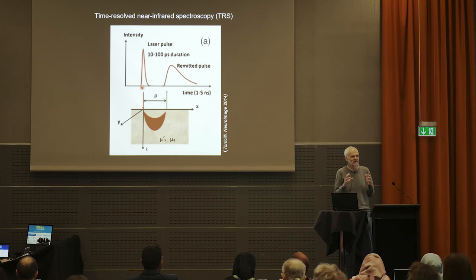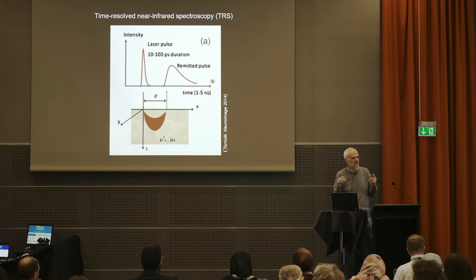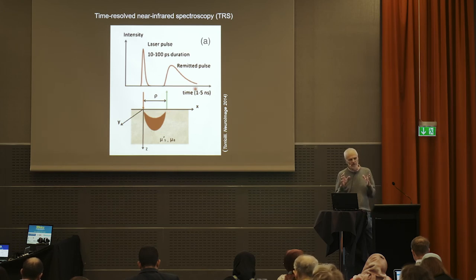It's somehow incredible. This is the same thing, a short pulse of light, and then the light comes back not at one instant, but in a spread out pattern. That's because the light which you have injected into the tissue is traveling around, and some goes directly back, and other photons have gone further astray and take longer time to get back. That allows you to look at those who come back late, because they have been far away, which means they've been deep into tissue. So that gives you simply a different way, and that is again the reason why you're able to detect at a distance. And that gives you, for physical reasons, a much better assessment of the absorption coefficient, and thereby a better definition of the hemoglobin spectrum, and therefore better saturation measurement.